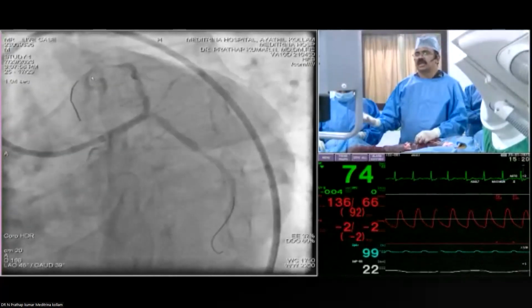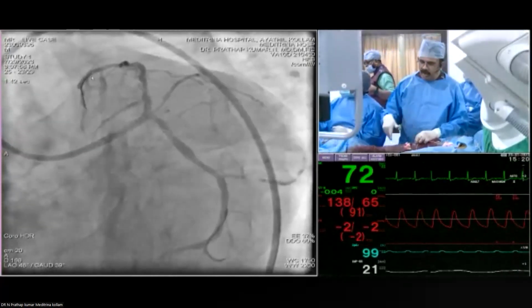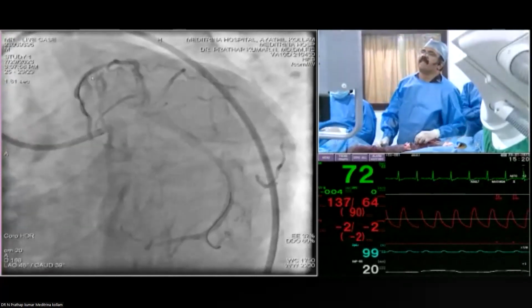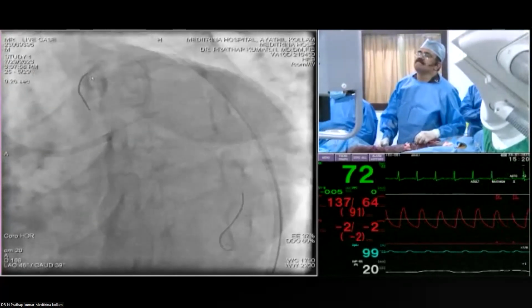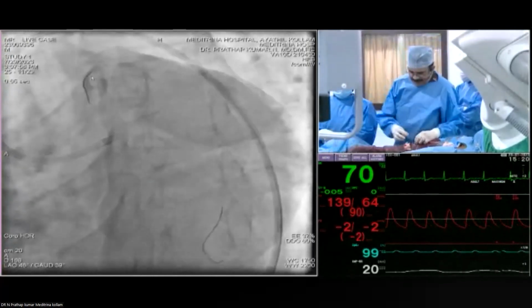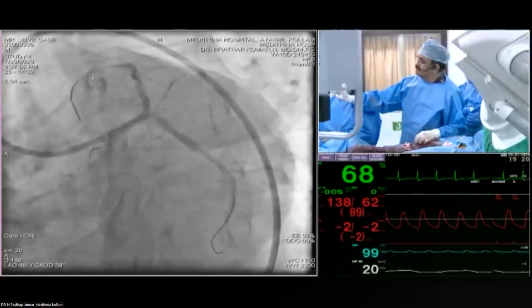Now I'll go with a stent into the circumflex and then balloon dilate and crush, followed by a recross and then DK. Then I just go with a stent from LMCA to LAD. No, you still have an excellent option to go here with a culotte approach, DK culotte. I don't know, why do you want to make DK culotte? We like DK crush, you know, the principle is actually DK crush.